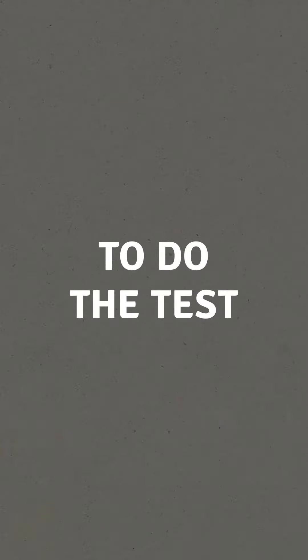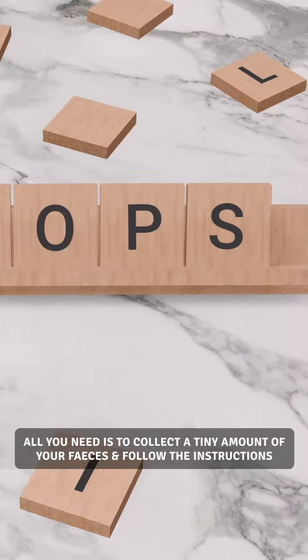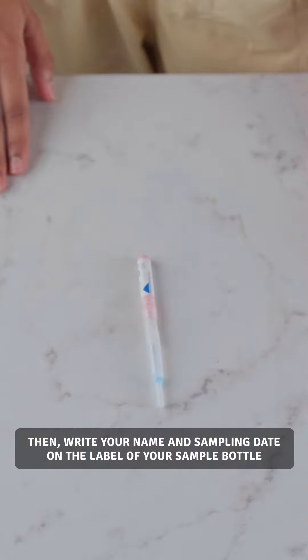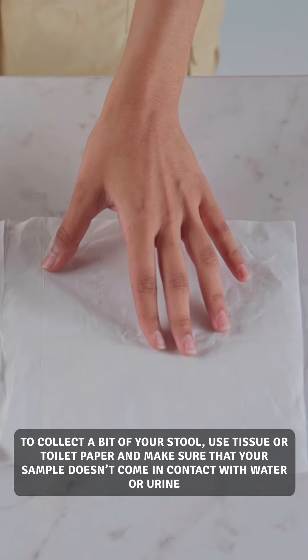To do the test, all you need is to collect a tiny amount of your feces and follow the instructions. Firstly, open the pouch and familiarize yourself with the items in the kit. Then, write your name and sampling date on the label of your sample bottle. Collect the sample for testing.